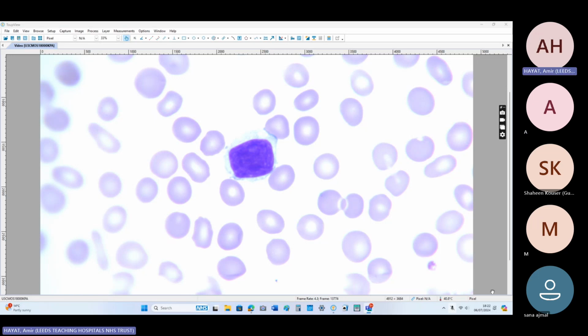Mantle cell lymphoma patients usually have abundant cytoplasm in their lymphocytes. Yes, but they again do not show marginal zone pleomorphism, because the cytoplasm is clear, it's not basophilic. No, they have one category of mantle cell lymphoma which has abundant cytoplasm and monocytoid type cells, resembling marginal zone cell lymphoma.